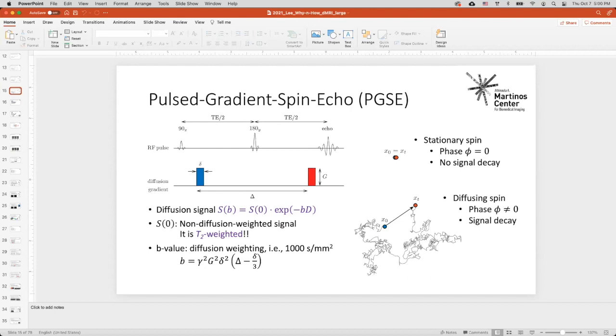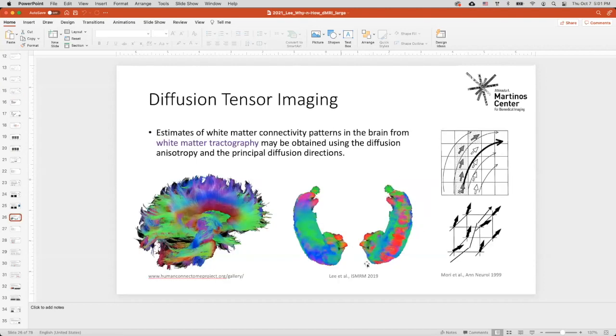It's called self-similarity. Actually, this is a very conservative, very conventional way to do the interpolation, and it works pretty well. So actually the hippocampus tractography I showed in this slide, I used this super resolution method in HCP data. So the resolution is about 0.7 millimeter isotropic. So we actually can achieve sub-millimeter resolution just by doing post-processing. And it's hippocampus, it's not cortex, so deep gray matter works too.